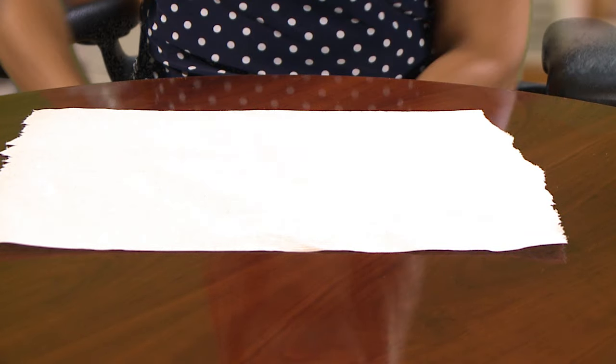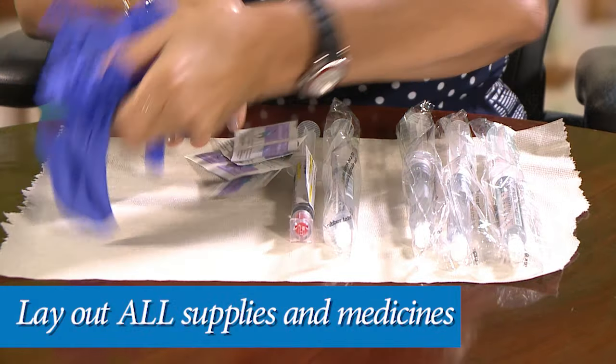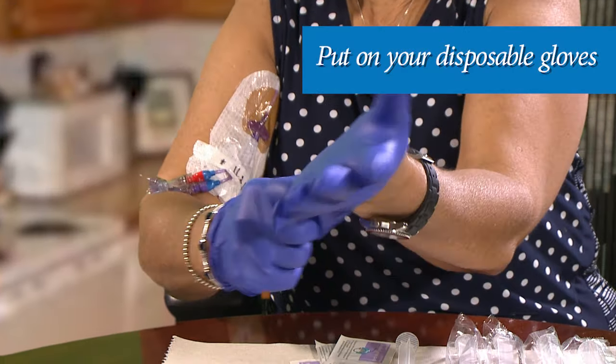Then place down a fresh paper or cloth towel. Now, lay out all of your supplies and medicines on the clean surface. Before starting to give your antibiotic, put on your disposable gloves.